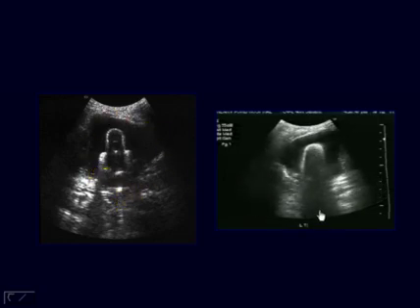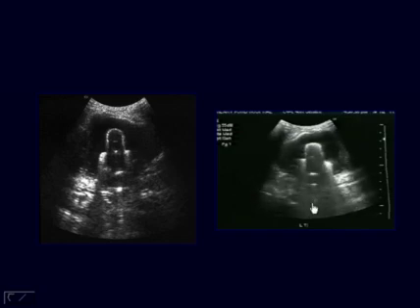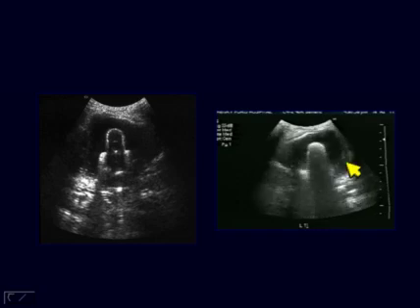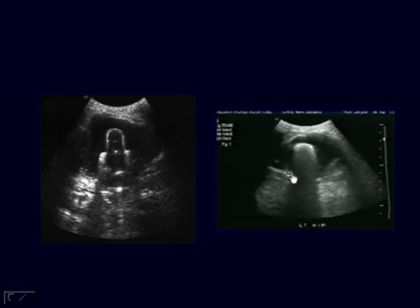So here you see dynamic imaging, wherein now you started on long axis, and on short axis you begin to see the prosthesis and the abnormal fluid collecting over it. But maybe some of you have already appreciated some punctate high-level echoes on the left-hand side of the prosthesis. We don't know if this is gas entrapped in the synovitis or maybe some debris floating.